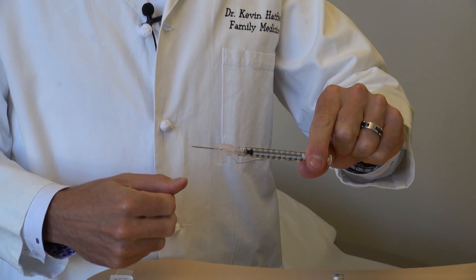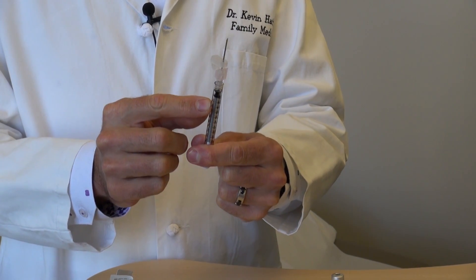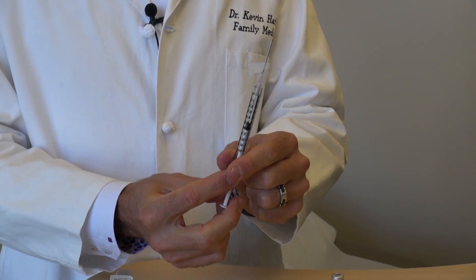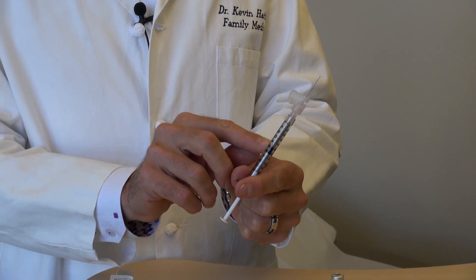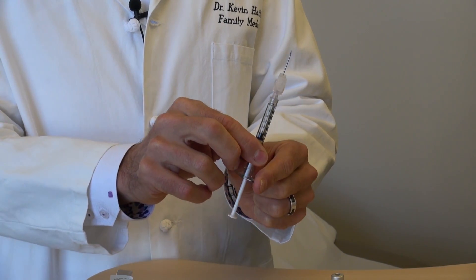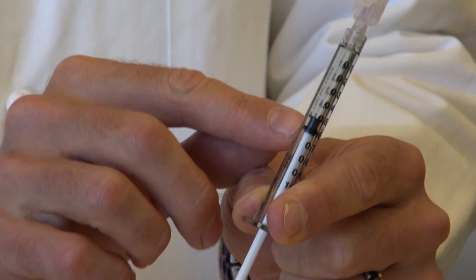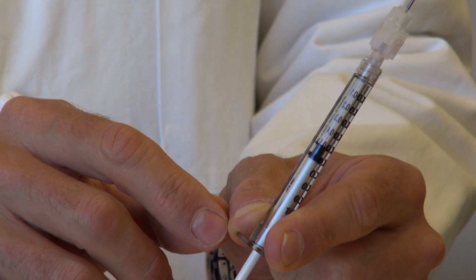Once the cap is off, put as much air in the syringe as the amount of medicine you're going to take out of the bottle. In this instance we're doing a 100 milligram injection — for each 0.1 milliliter there's 20 milligrams of medicine, so 100 milligrams is a 0.5 milliliter quantity. Make sure the top of the plunger aligns with the 0.5 demarcation on the syringe.